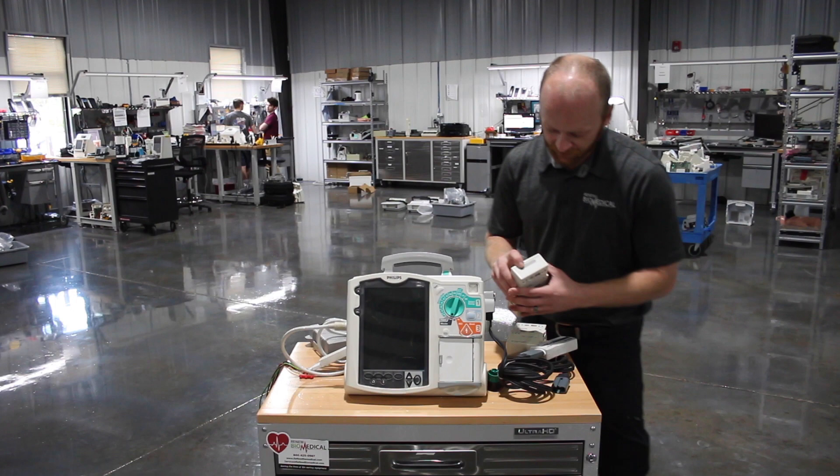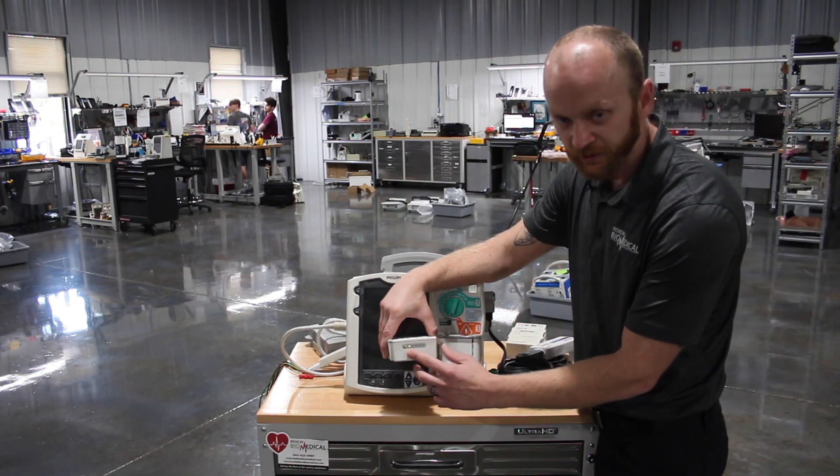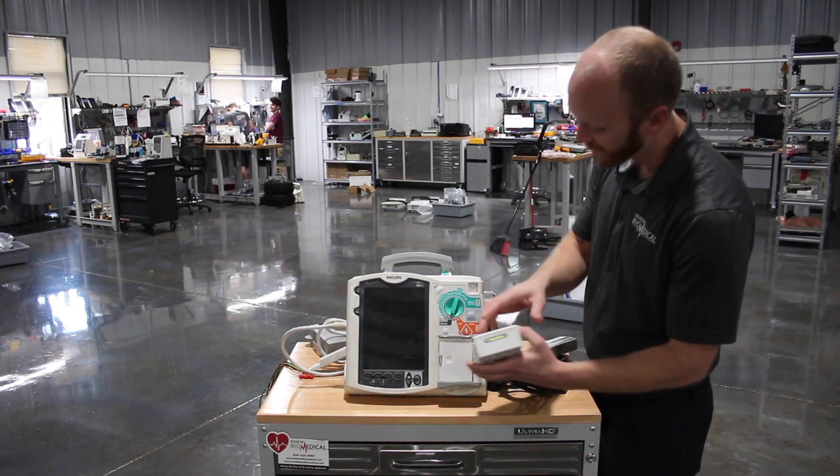On the batteries you'll see they have the LEDs. If it's blinking, that's letting you know it needs to be reconditioned. A good battery should have a full charge.